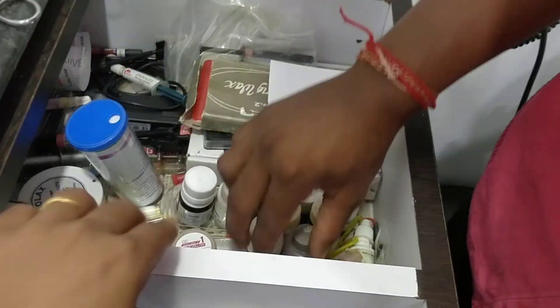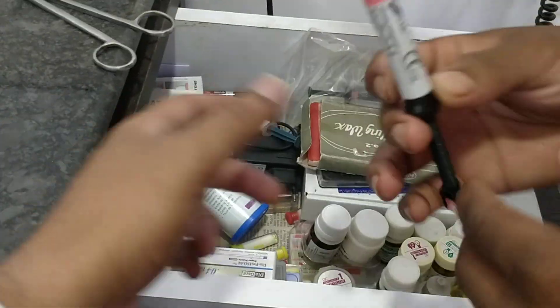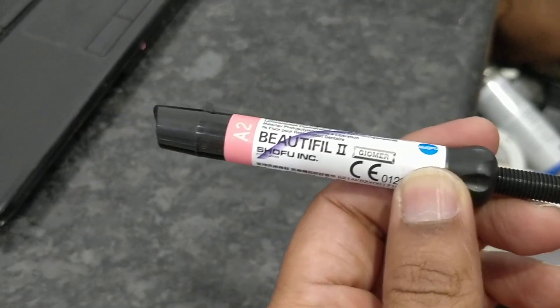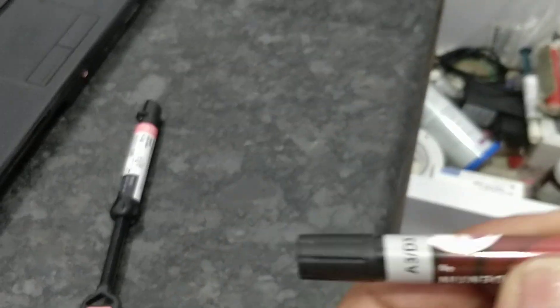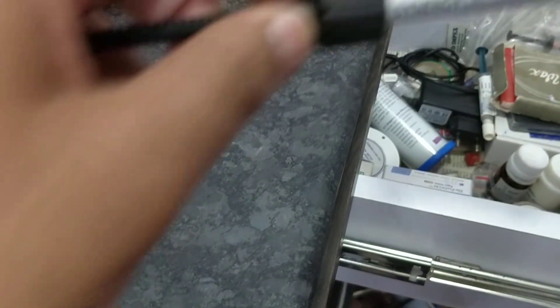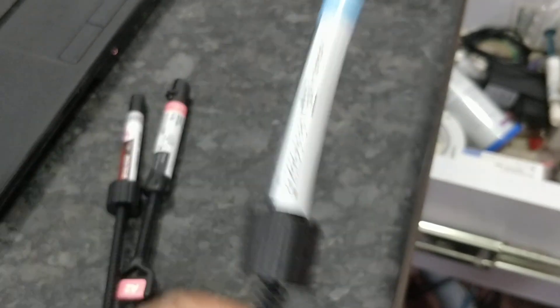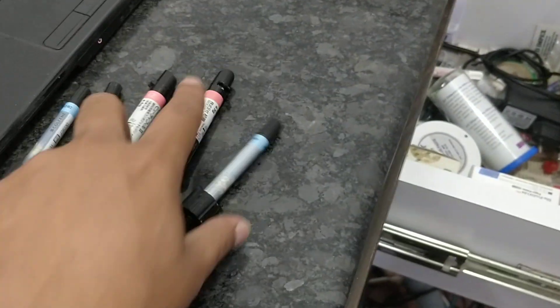This is the second box where we have kept the filling materials and restorative materials. This composite is beautiful — it is by Shofu. This is the A2 shade, 4.5 gram, price is around 1250 rupees. This is another one — Coltene Brilliant NG — I have got the A3 shade, which costs around 1000 rupees. And this is another composite I am using: Synergy D6, also by Coltene, price is around 1400 rupees. A few other shades are also there — so a lot of composite material.